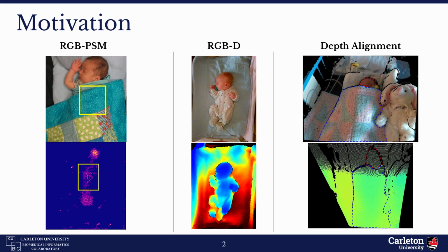The use of these modalities in conjunction with one another can reveal scene information that can't be derived from studying one data source alone. For this purpose, we demonstrate a few registration techniques to align or otherwise combine the data from multiple sources and quantify the error of the registration techniques.